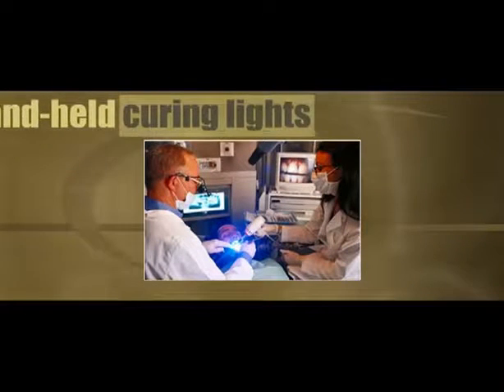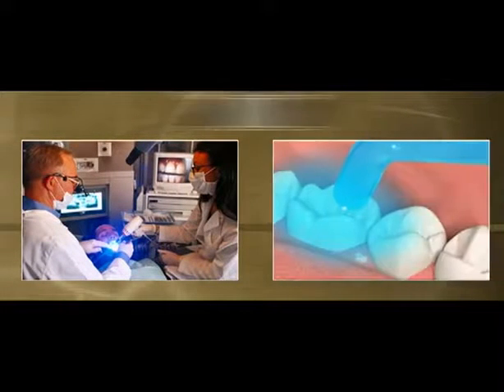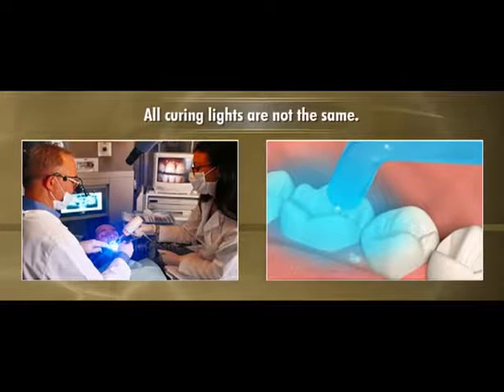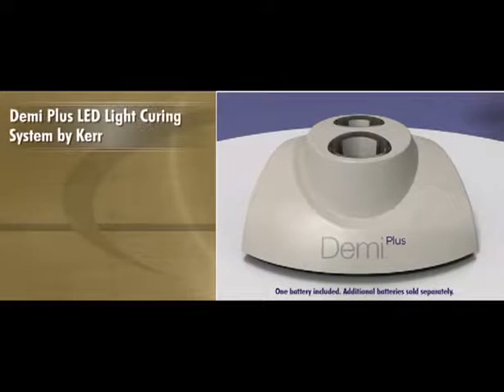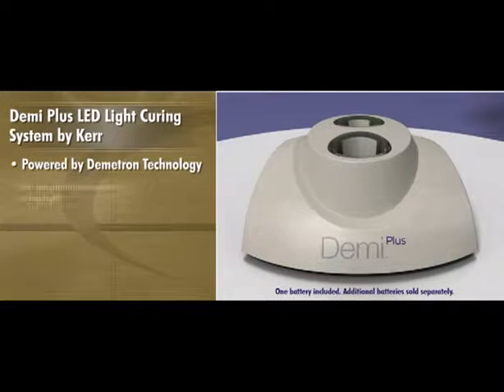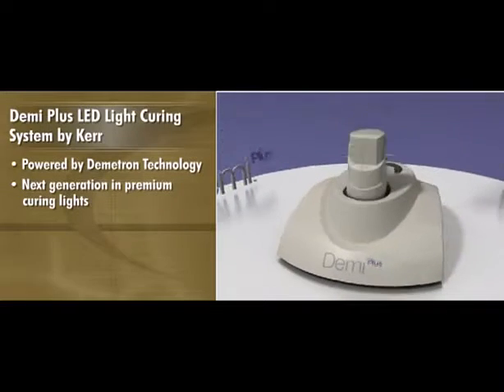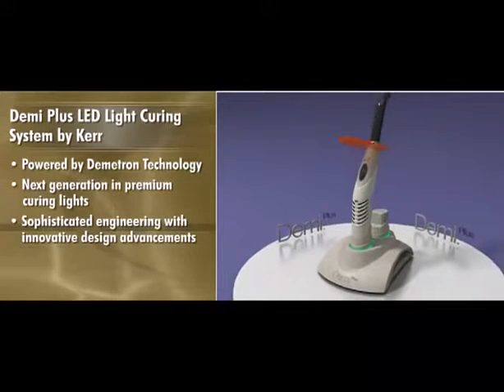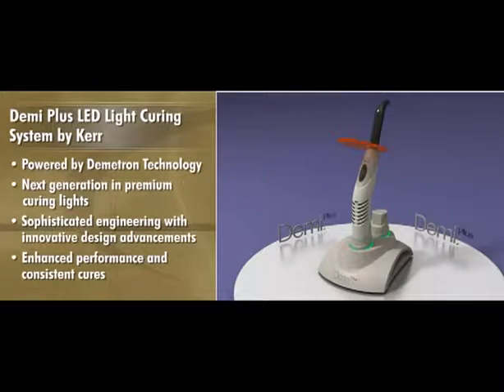Handheld curing lights have long been an essential part of every dental operatory. However, all curing lights are not the same. Demi Plus LED light curing system by Kerr, powered by Demetron Technology, is the next generation in premium curing lights. It combines sophisticated engineering with innovative design advancements that enhance performance and deliver consistent cures while allowing you to focus on what's truly important – your practice.